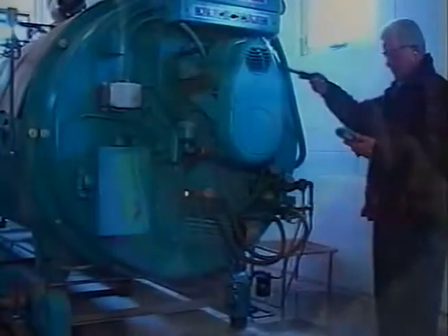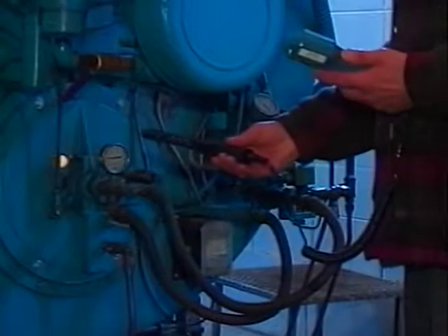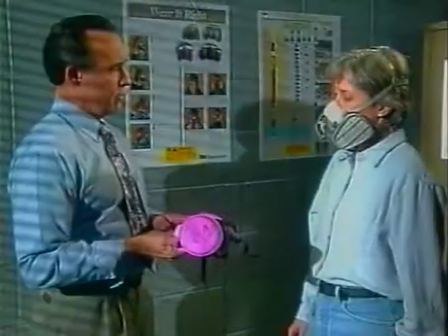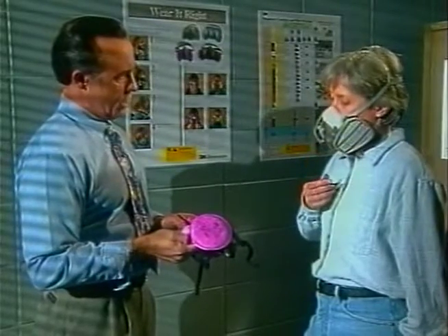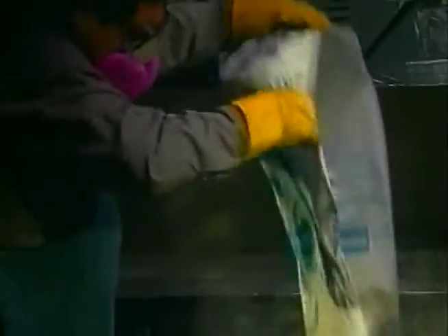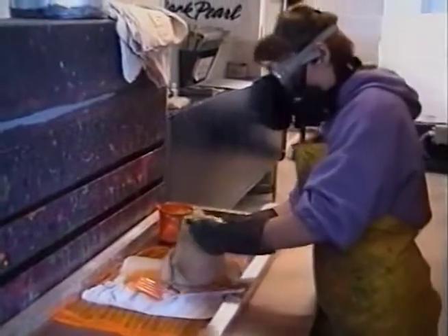The airborne contaminants that have been identified must then be measured using appropriate sampling equipment. Once the contaminants have been identified and their concentrations determined, a respirator that is adequate for the job can be selected. The CSA standard referred to earlier is an excellent source of information for the selection of respirators.